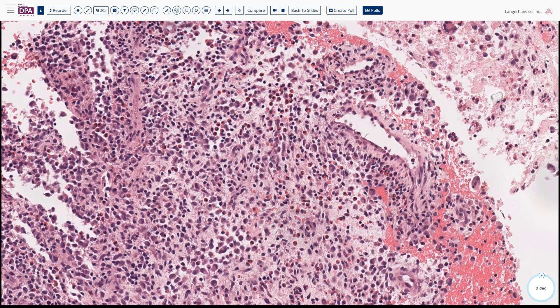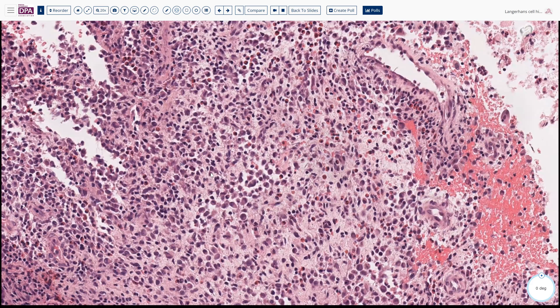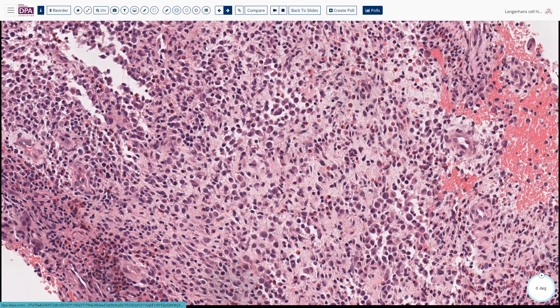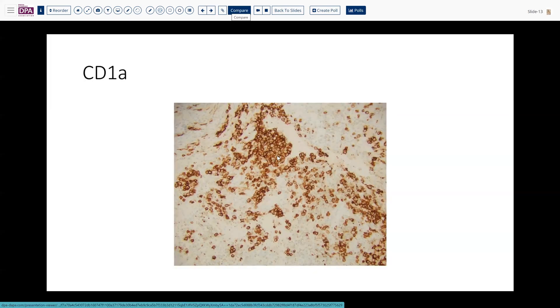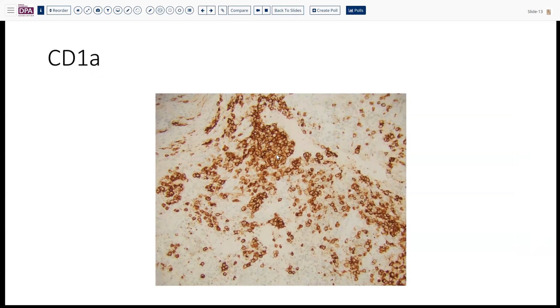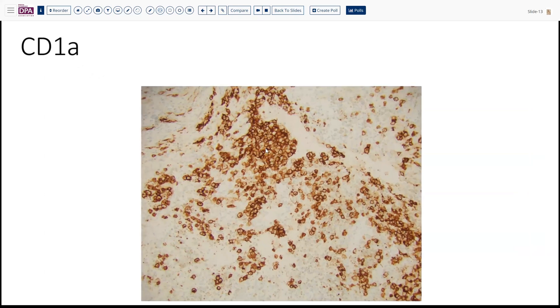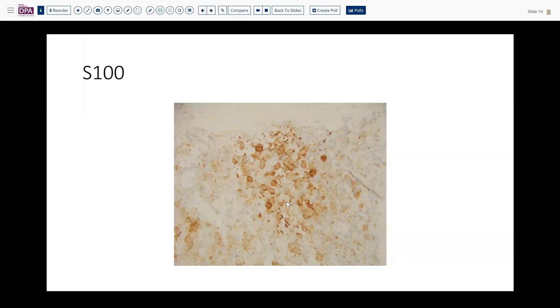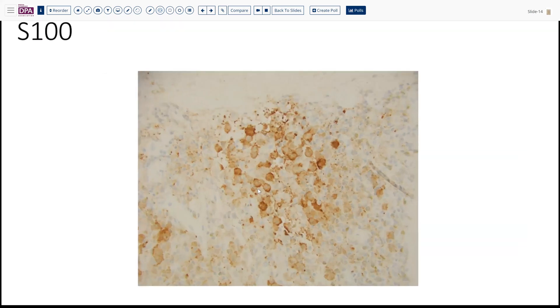The original thinking was that these cells were histiocytes and eosinophils represented a partial response to a granulomatous process. However, we've since recognized this is not truly a granuloma, though these cells do exhibit markers suggestive of histiocytes. They react with CD1A, staining the membranes and cytoplasm, and are generally S100 positive.